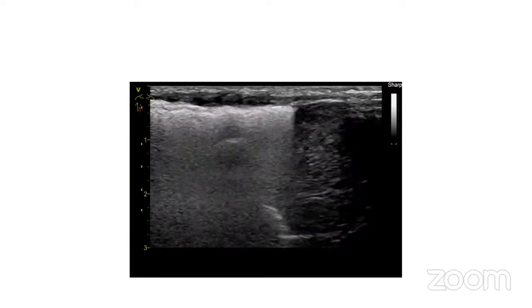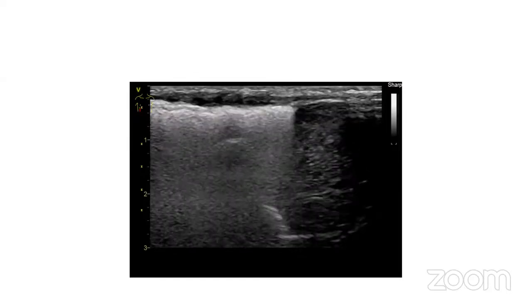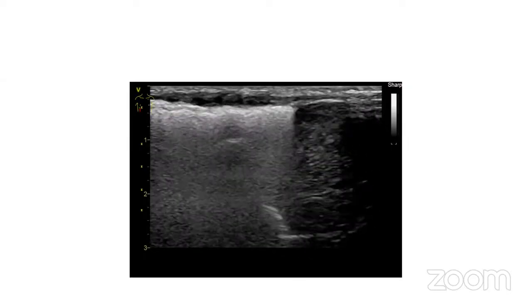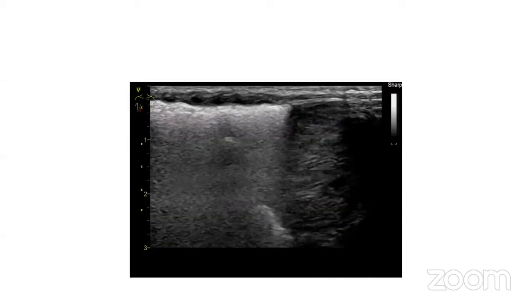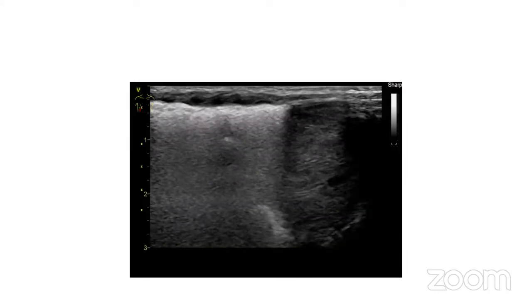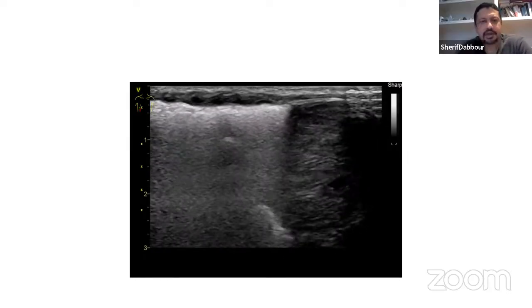From the images that we've looked at on babies with chronic lung disease, it's really less aerated lung, probably predominantly a B profile, with some fluid mainly causing this. This is my feeling about the chronic lung disease. Was that the question, chronic lung disease or PIE? My question was mainly about PIE.